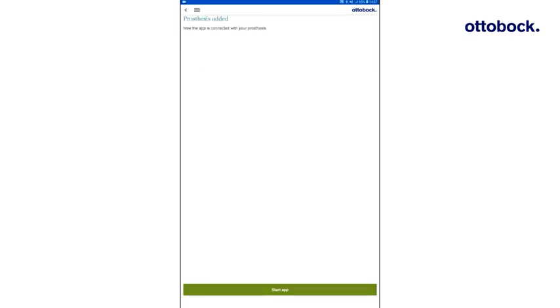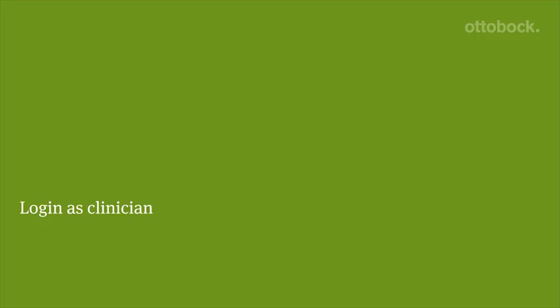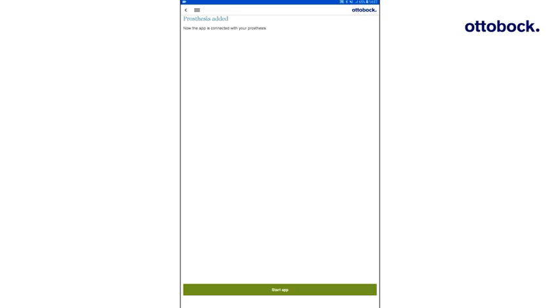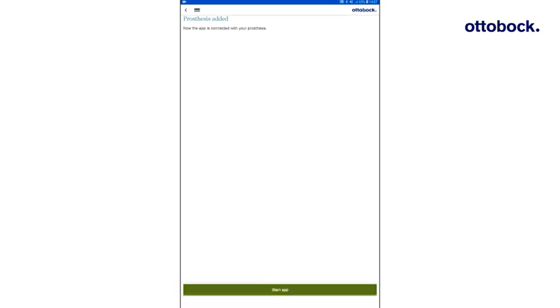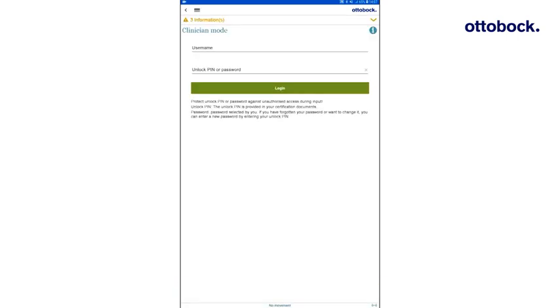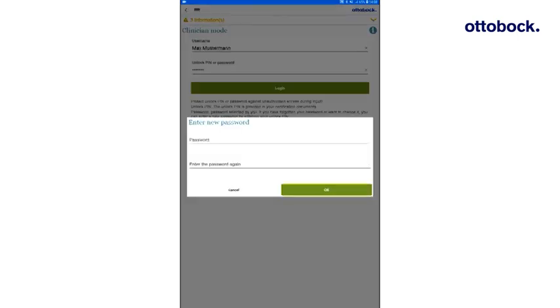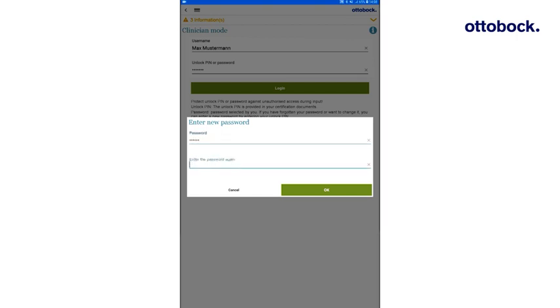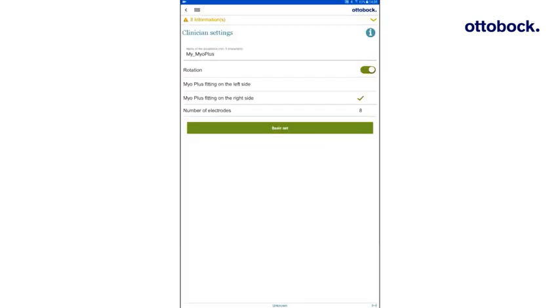The app is now connected successfully to the Myo Cuff. By pressing Start App, you will be forwarded to the clinician login page. Enter your username and PIN. These have been provided during certification. Define a personal password that can be used instead of the unlock PIN. Confirm with OK. You are now logged in as clinician and will be forwarded to the clinician settings.